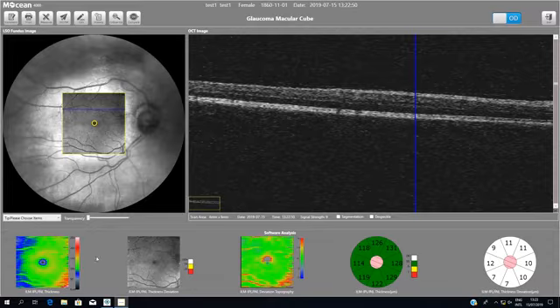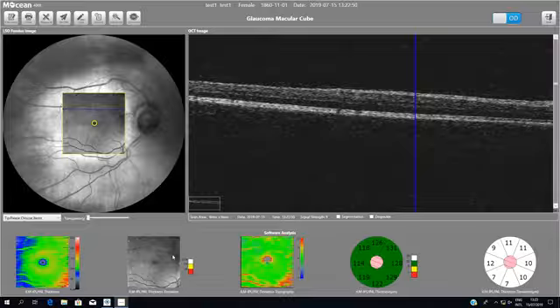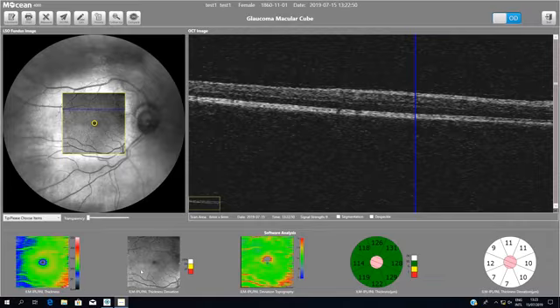At the bottom, you have the ganglion cells complex thickness in a pseudochromatic map, which means the green is okay, and of course you can compare it with the absolute values. At the second map, you can see how some points deviate statistically from the normal corresponding values.